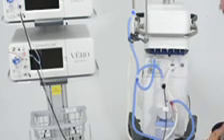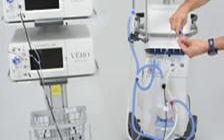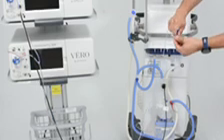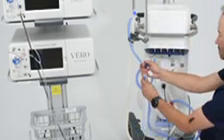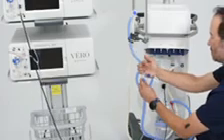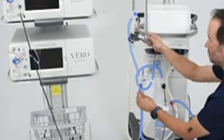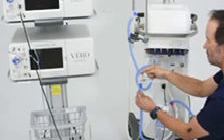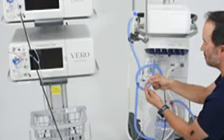Push and twist clockwise the luer lock collar of the sample line onto the sample port of the gas sample tee. Place the gas sample tee in the inspiratory limb of the patient's circuit. Gas sample tee should be placed 6 to 12 inches from the patient's circuit Y. Ensure the blue stopcock valve is in the open position as shown.